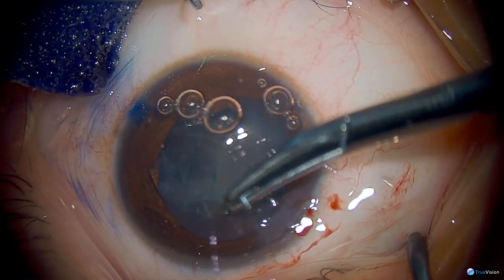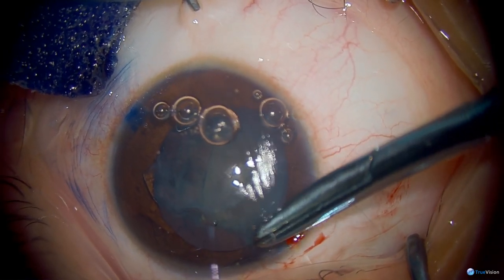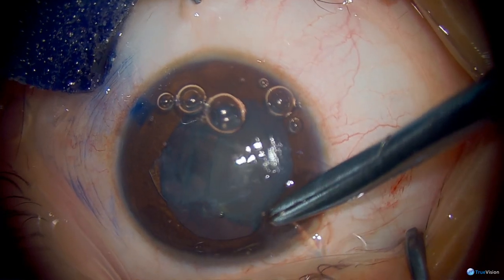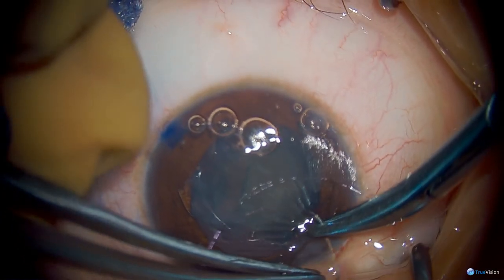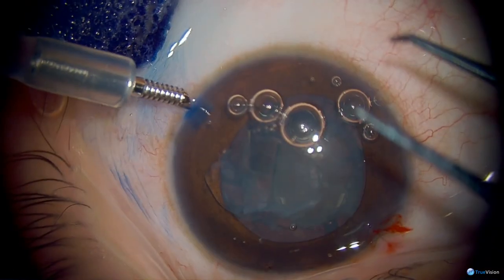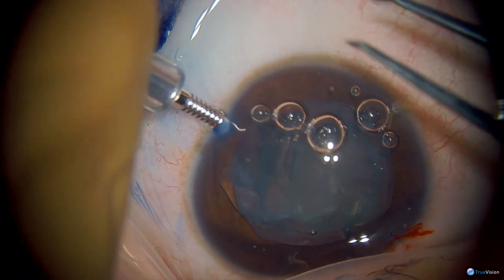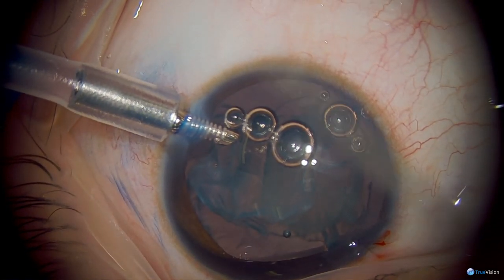Now here you can see sutures being placed over the incision because we're using a vitrectomy handpiece and an infusion cannula in this case. If you do that through a larger 2.5 millimeter incision, which was utilized for the capsulotomy, you'll have too much leakage around the vitrectomy handpiece. So you'll want to close that incision down slightly.